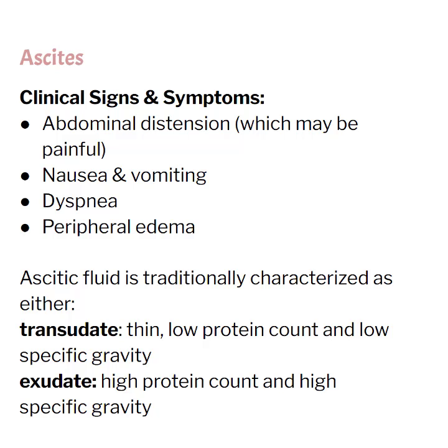As she lays down, she looks very rotund. Not a huge woman by any means, but her abdomen was very distended. And I even knew before I put the probe down exactly what I was going to see. And sure enough, her whole abdomen was just full of ascites.